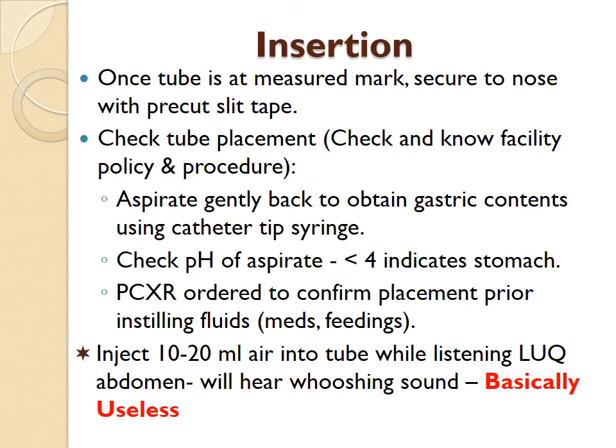You want to gently secure it, not so that you don't want it to be able to move, but so that you're also not pulling their nares up, because it will cause breakdown of the tissue very easily. Now you're going to assess for tube placement.